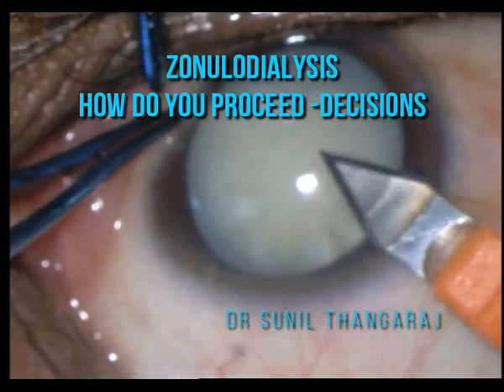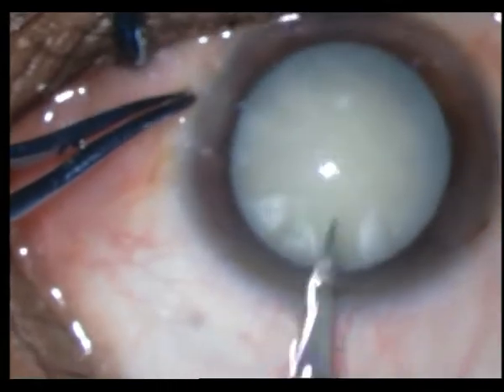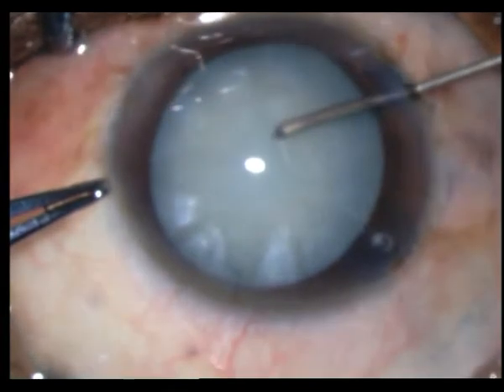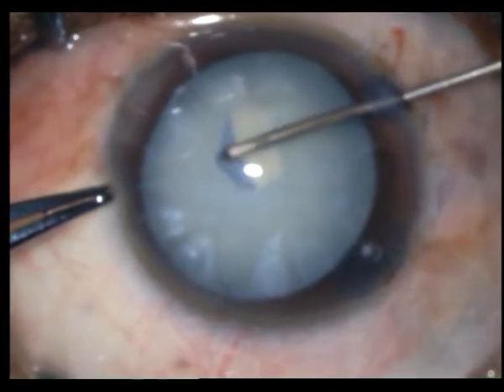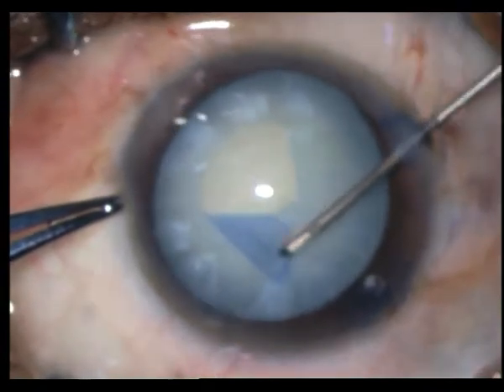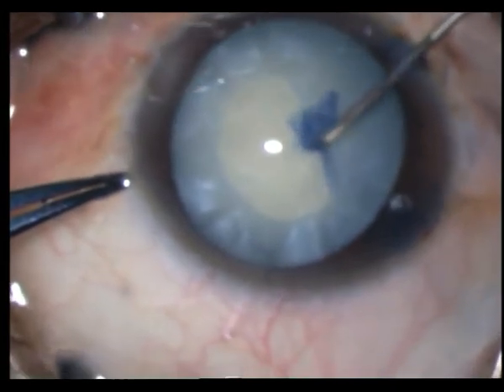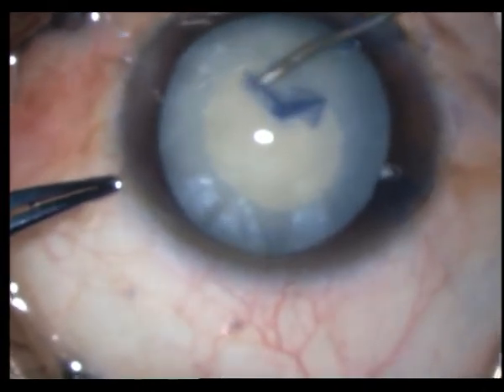This is a routine phaco emulsification in a fairly mature, not intumescent cataract. I place my 2.8 millimeter initial keratome incision, make two side ports, and now I'm fashioning my capsulorhexis with my cystitome. There is no egress of fluid, no fear of any Argentinian flag sign developing. One has to be careful to make an adequate rhexis — and everything is going to plan.